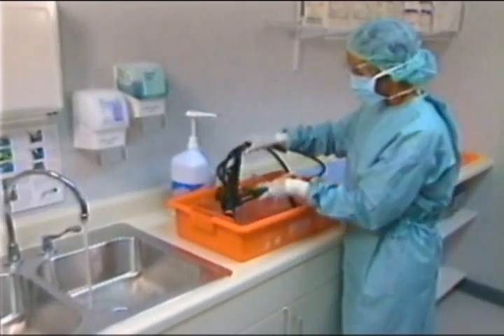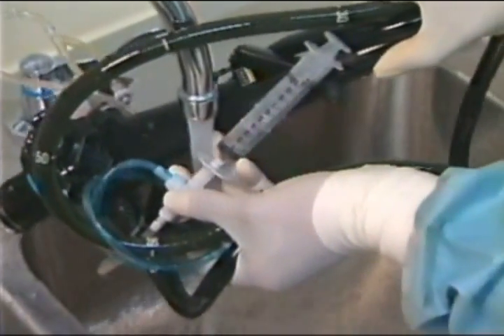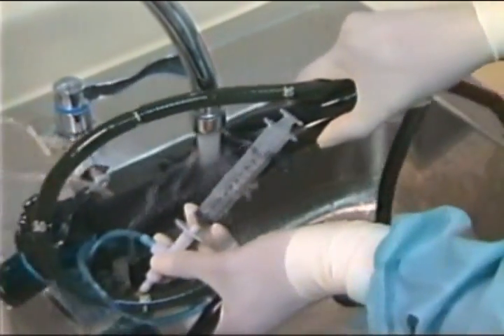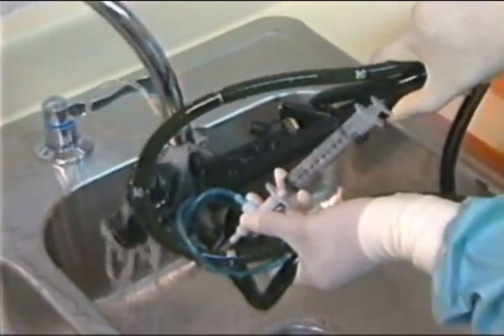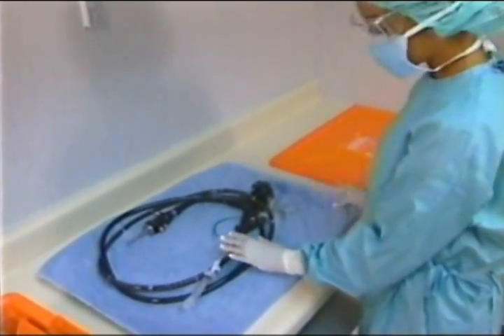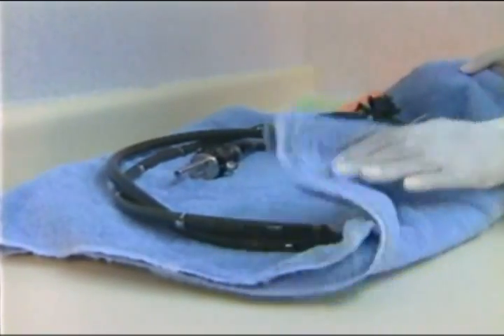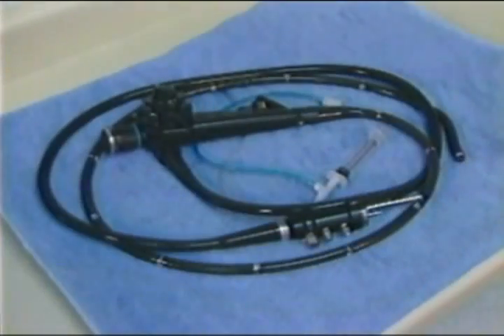Following cleaning, it's important to thoroughly rinse equipment with large amounts of fresh water. This will remove residual detergent on the instrument's surfaces prior to disinfecting. Remove excess moisture left on instruments prior to disinfection, as this will help prevent excess water from diluting the solution, which can reduce the effective concentration of the product.